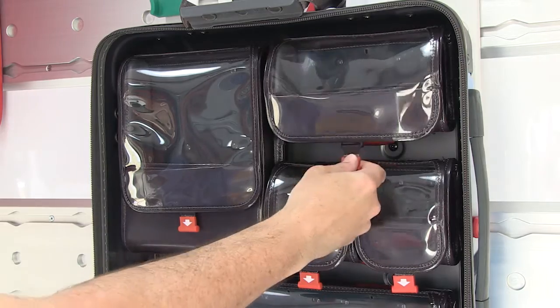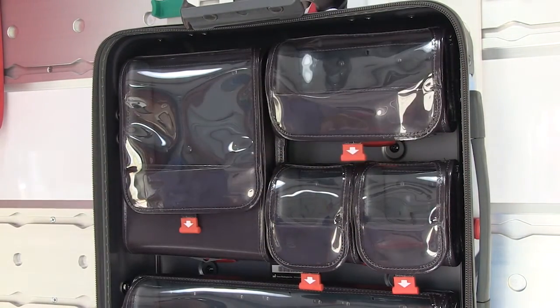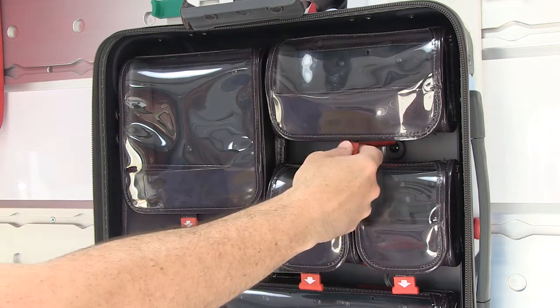To open a pouch, pull the red tab down to release the magnetic latch. Lift the clear flap upward to access contents.